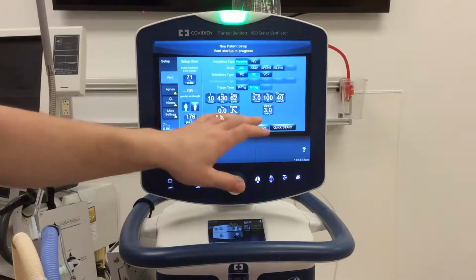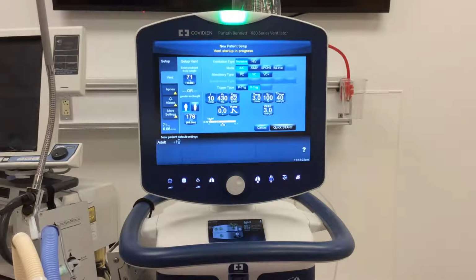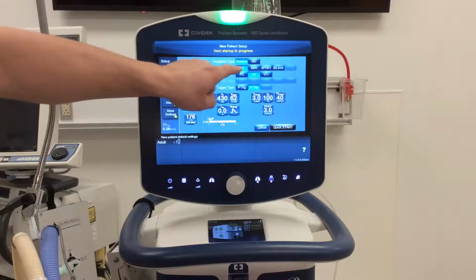It's going to bring me to this screen where it's allowing me to choose a few different things. First off, ventilation type. Would I like to do invasive ventilation or non-invasive ventilation? A majority of times we're going to be focused on invasive. It is useful to realize, though, that all of these modern ventilators are actually quite proficient at being used as non-invasive devices. We'll focus on that a little bit more as we get into weaning in the fall, using the machine as non-invasive ventilation. So for our purposes, we'll be choosing invasive mode.